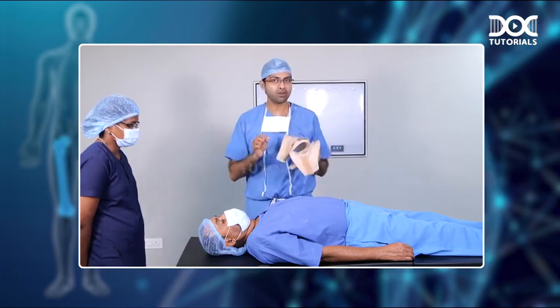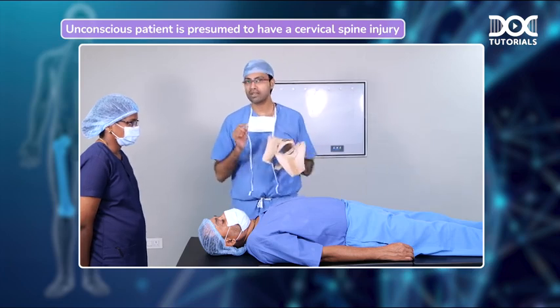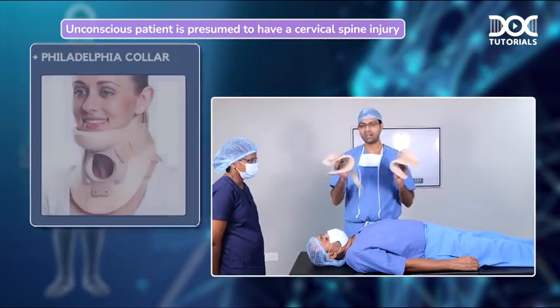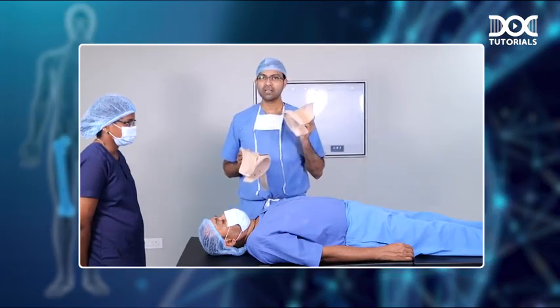So remember, any unconscious patient, you presume that the patient has an associated cervical spine injury and you treat him accordingly by putting a Philadelphia collar. Understood? So Philadelphia collar, remember, has two parts.